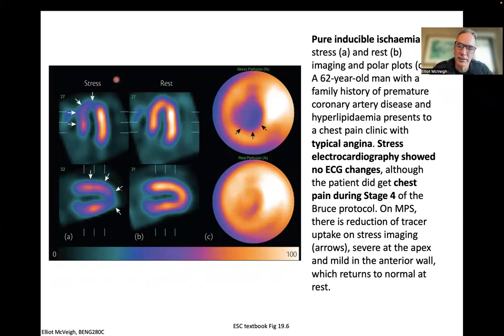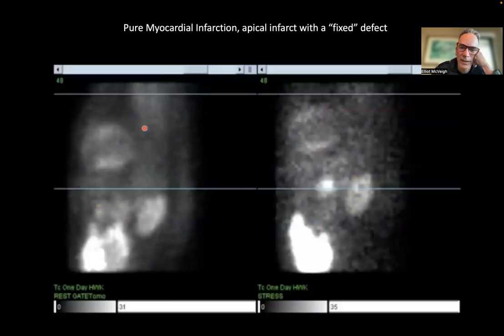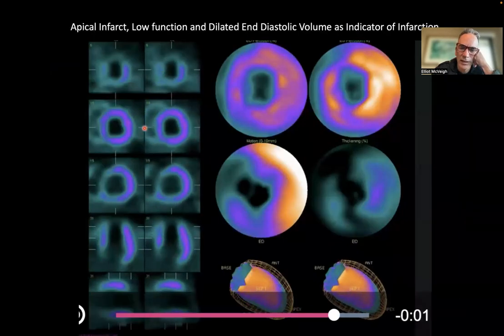I will put this entire, I think there's a movie I have for the rest of the explanation of this, of these cases where you have a lesion show up in stress and it resolves at rest, versus one that's in stress, it doesn't resolve at rest. So this is probably like the whole apical cap is probably an infarct, etc. But I think that will be on the movie.